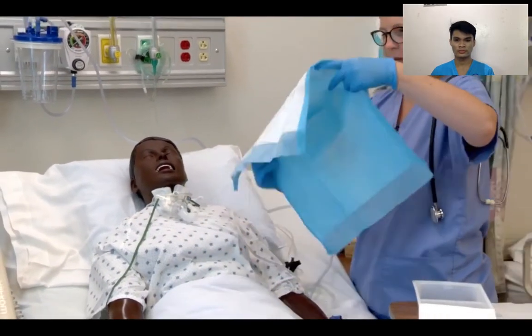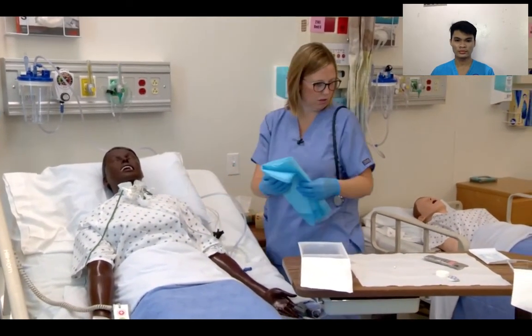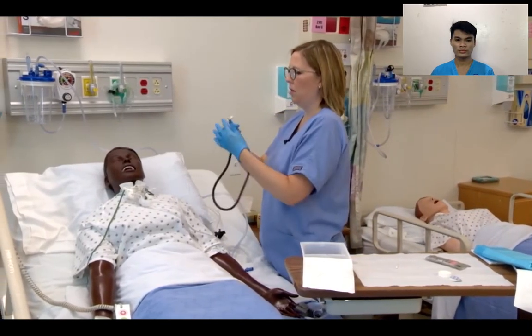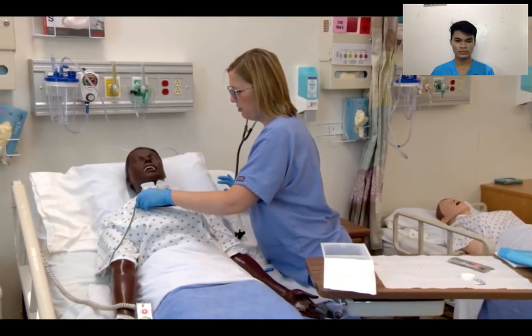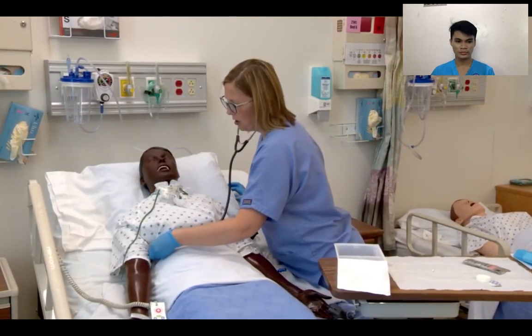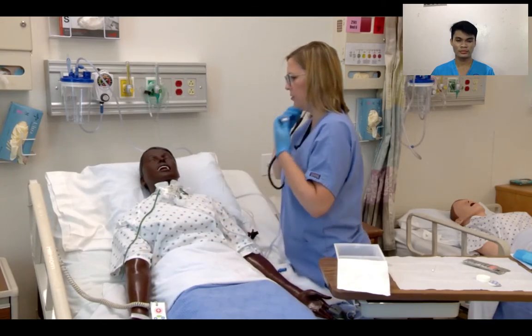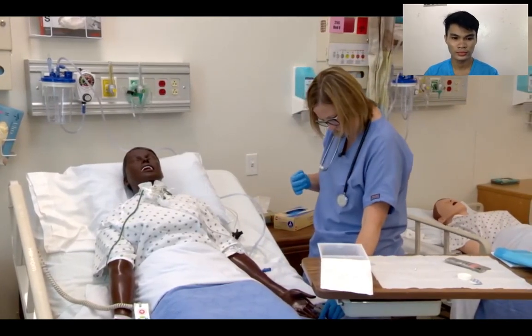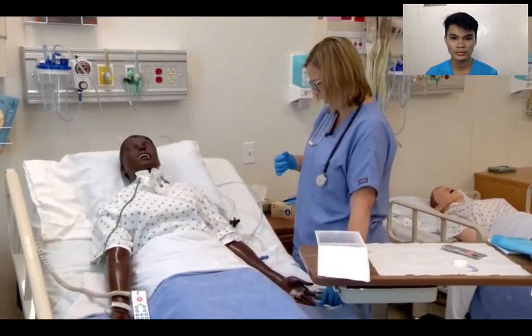Okay, reapply the oxygen. Doing okay there, Mr. Jones? Okay, good. I'm going to reassess now. Listen for my lung sounds again. Take some deep breaths for me. Again. Again. Again. Okay, sounds much better. And then let's look at what your pulse ox is reading. Your pulse ox is much better. It's up to 97%. That's good.